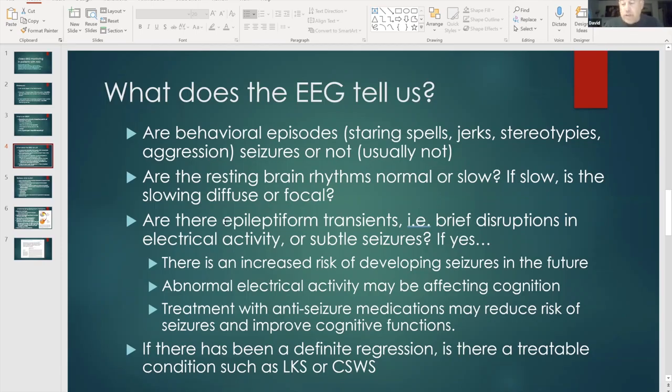As I mentioned, a routine EEG, whether that be 20 minutes or 45 minutes or an hour, in a clinic, oftentimes doesn't capture an adequate amount of sleep. Historically, the routine EEG is 20 minutes long. A 24-hour video EEG study will capture at least 50 times the amount of data, which provides us with a lot more brainwave activity to analyze. And sometimes that 20-minute or even that 45-minute outpatient study contains no sleep at all, which, as I've mentioned in the previous slides, is really a critical component to analyzing EEG and for epileptic activity.